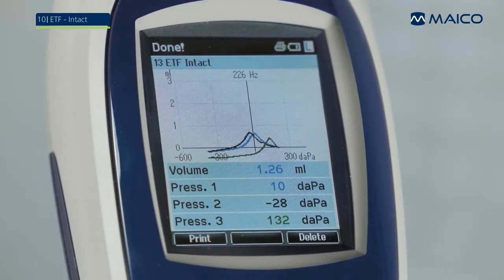The 3 tympanograms are displayed in various colors for easy differentiation. Red or blue represent the test ear, gray represents swallow, green represents Valsalva maneuver.